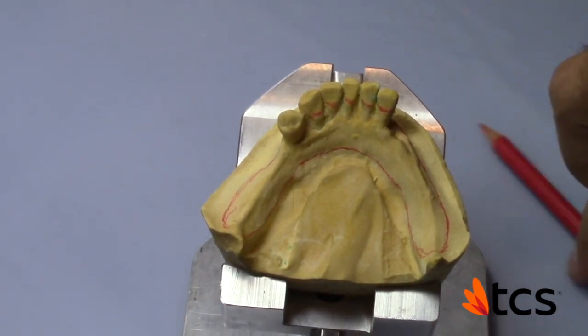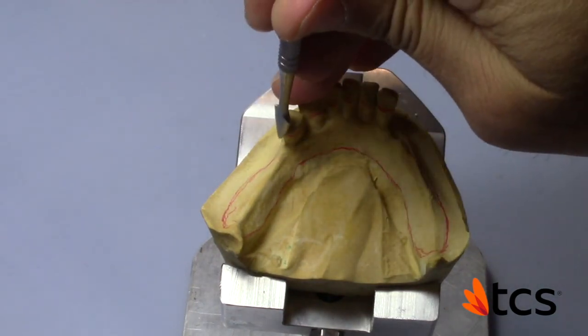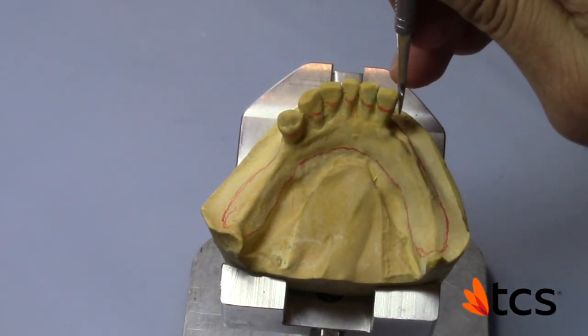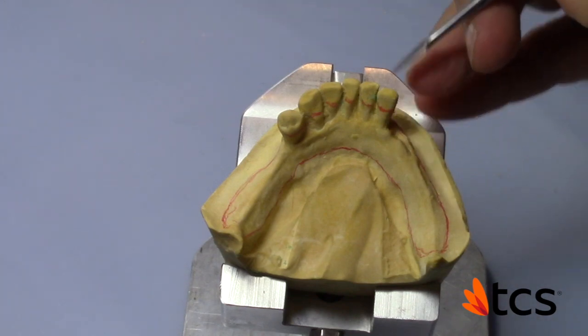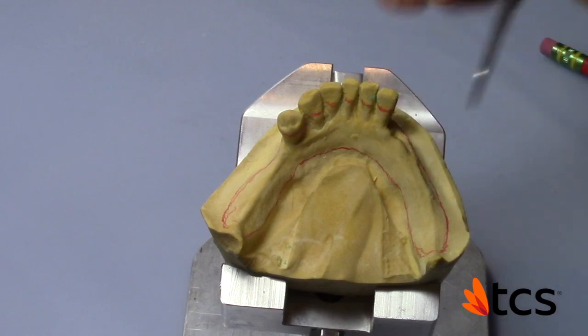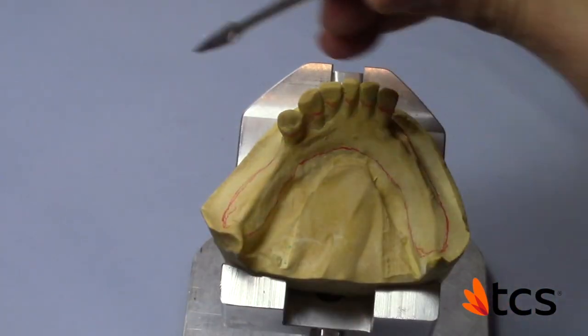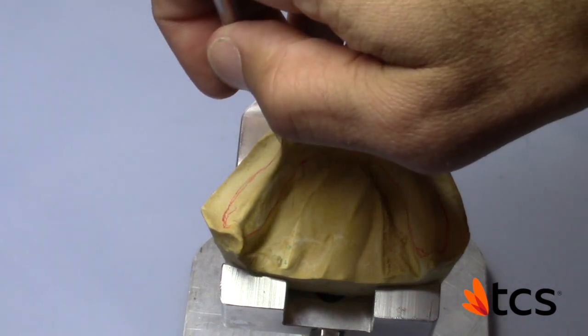Where you're going to find the most resistance is in this area here. You can't block it out a hundred percent, because once it gets into the fitting zone you can actually move it — and we don't want that.